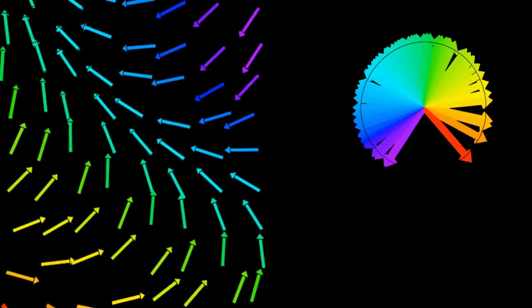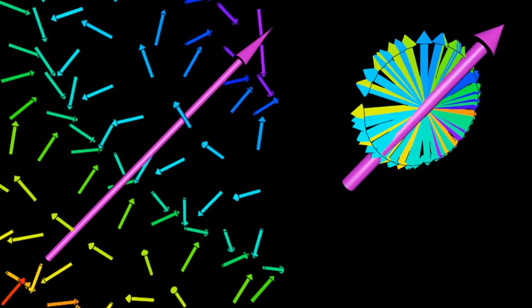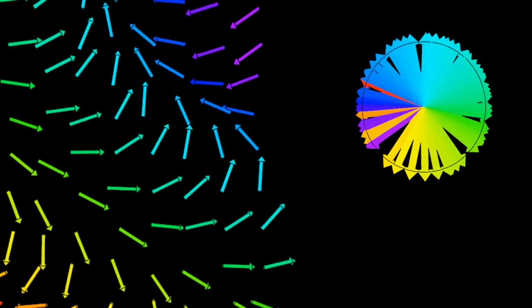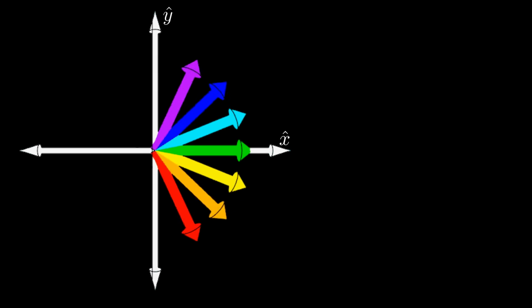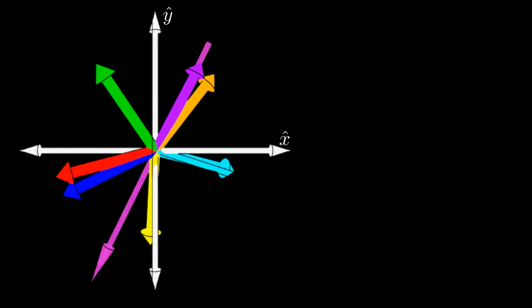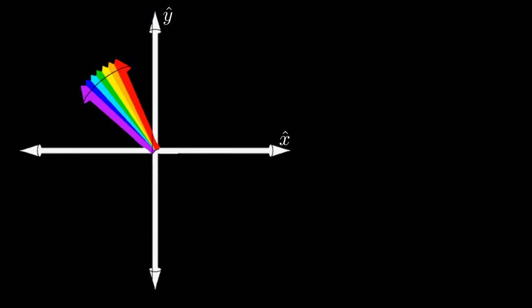We still get an echo, but it appears along the y-axis. Thus, we can expect our echo to have a different phase as our FID, just like we saw earlier. I'll simplify the animation here with just a few spins to illustrate the effect of delivering B1 at different orientations in the rotating frame. Notice the green spin does not precess here.